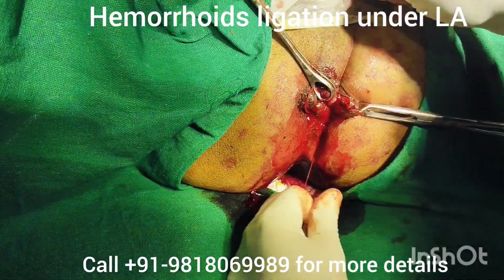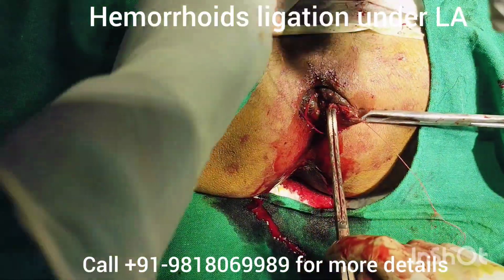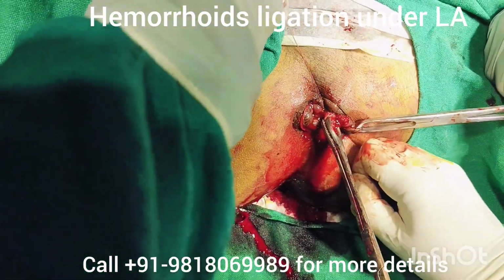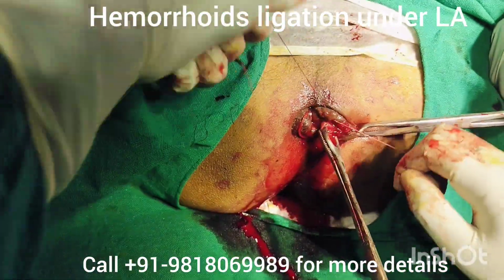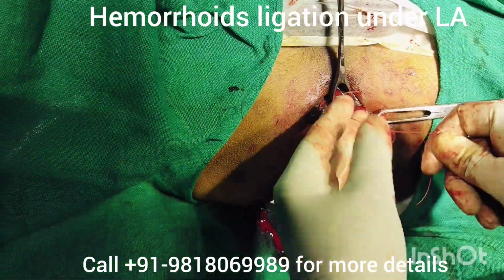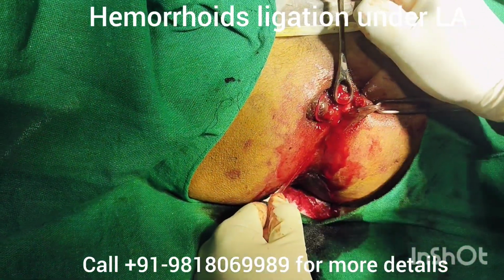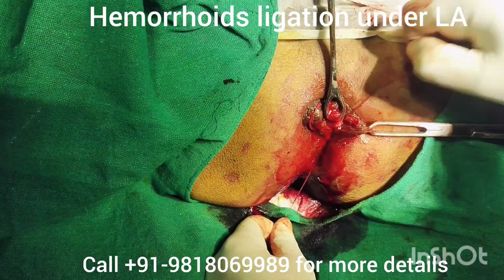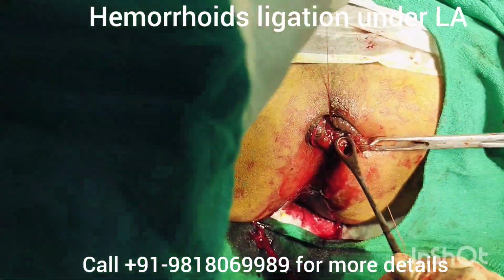After ligating this hemorrhoid, we shall ensure that if there is any oozing or bleeding, then that will be addressed, and finally dressing will be done after this. In this way we shall conclude this procedure.